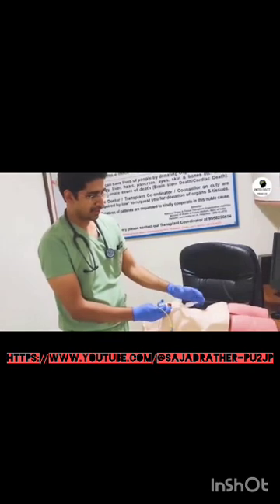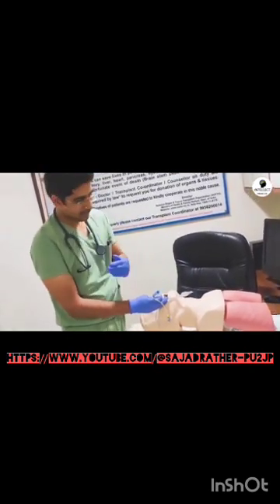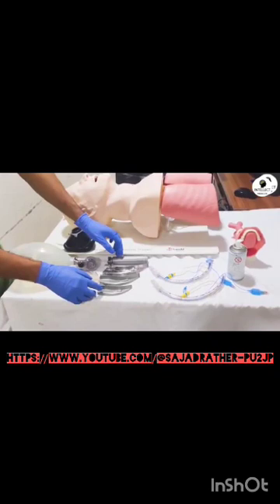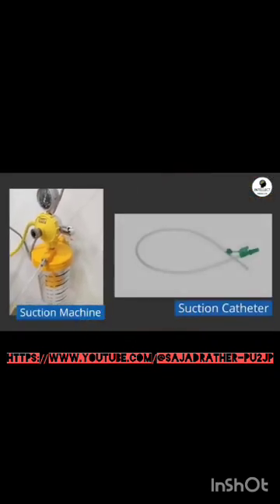And that depends again on the patient profile. If the length of the neck is short, a short neck, then the depth to be inserted is on the lower side. So that depends on the patient again. Along with these equipments, you need to have a properly functioning suction machine and a suction catheter.